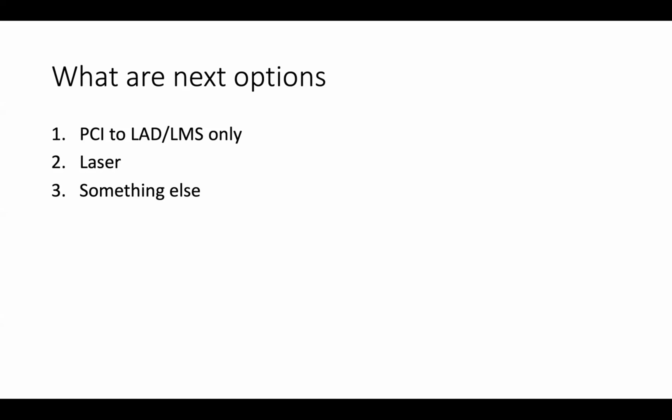When nothing was going, the microcatheter is not going, you take a slightly bigger balloon, like 2 millimeter, and inflate it after wedging it in a small part of the lesion. When you deflate it, you push it again and inflate, do 2 or 3 inflations, and sometimes the balloon might suddenly go. If the balloon doesn't go, the microcatheter quite often goes after that maneuver. I have used this technique multiple times for pushing the microcatheter further, honestly.